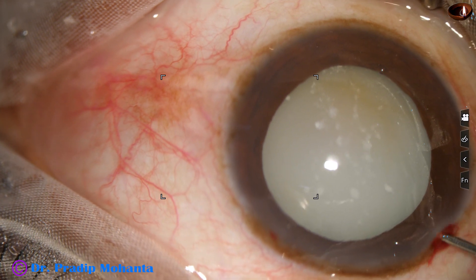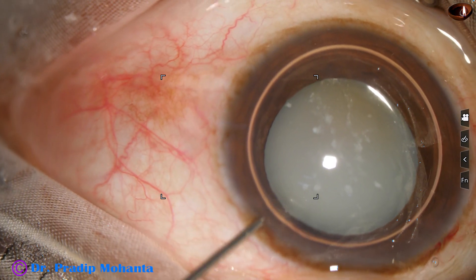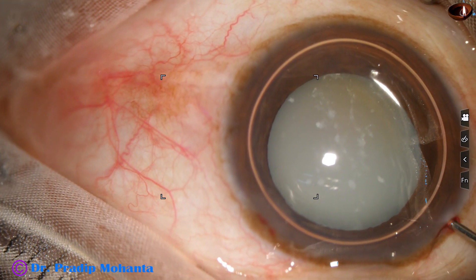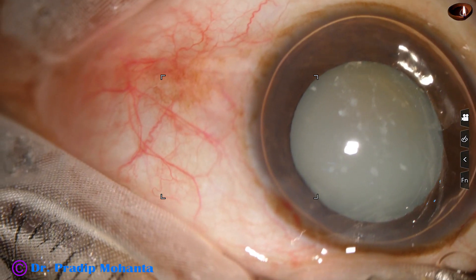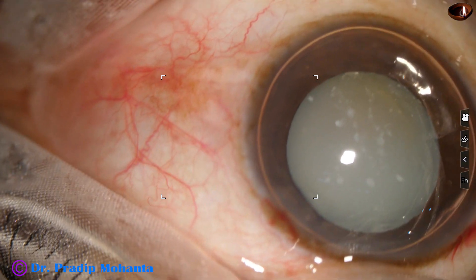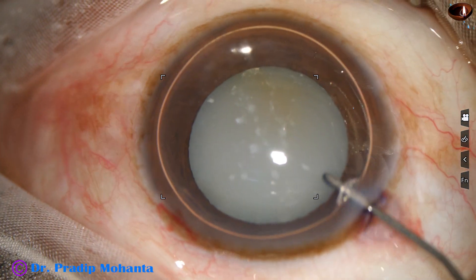A big air bubble is injected into the anterior chamber. Trypan blue dye is applied over the anterior capsule underneath this air bubble. Here goes the trypan blue dye.